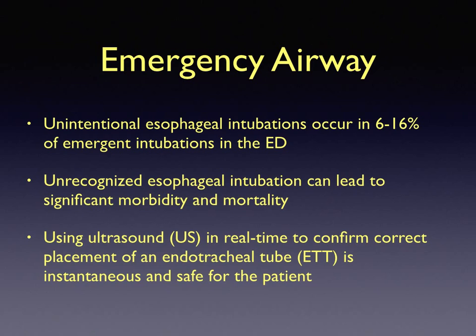Unrecognized esophageal intubations can lead to significant morbidity and mortality, and are more likely to occur in emergent conditions, so early detection methods that quickly and accurately assess tube placement are necessary in the emergency department.